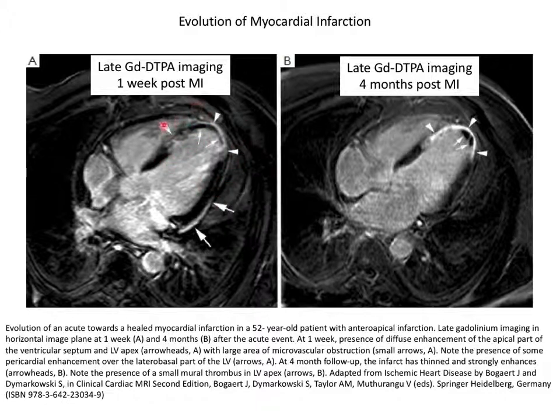So you see this in the acute phase, and then this is what that patient looks like 4 months later. Right? So there's an evolution of this tissue that goes from this acutely damaged tissue to a chunk of tissue that's repaired itself through fibrosis. So it's made a scar, essentially. So here you had a very fresh insult to the tissue. The tissue would look all swollen and hyperemic in a way. And then here you'd see basically a scar.